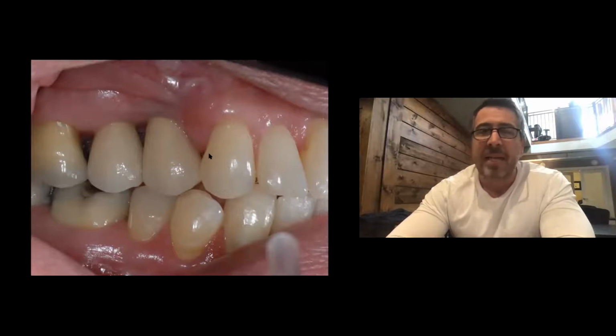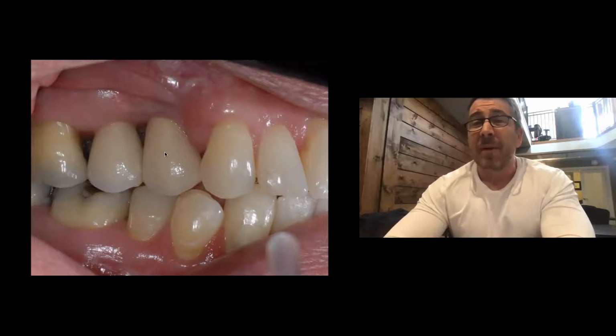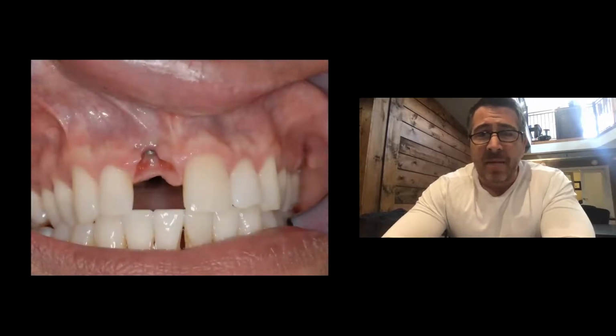So again, is that predictable? It is. I would tell that patient from the beginning looking at that case, you've got so much vertical bone loss there, you're never going to have perfect papillas between the teeth. But I think we got it down to a pretty reasonable level. We did that with implementing some orthodontic work prior to extracting the teeth. So for papillas, it's all about interdental height of bone. That's your main determining factor. For the zenith, we're going to have to look at where the crestal bone is.